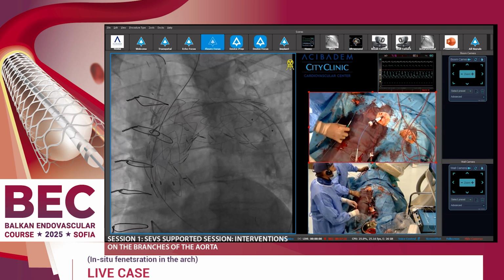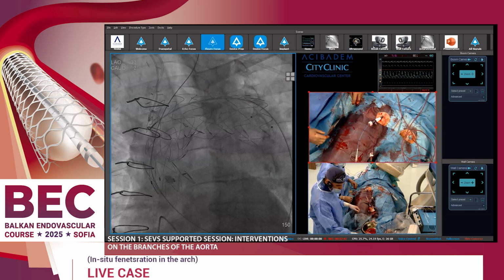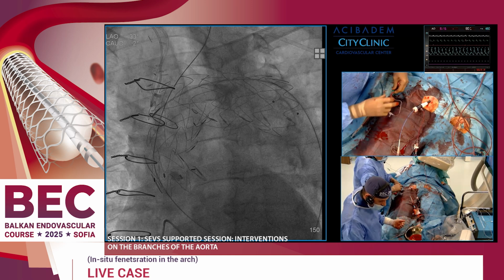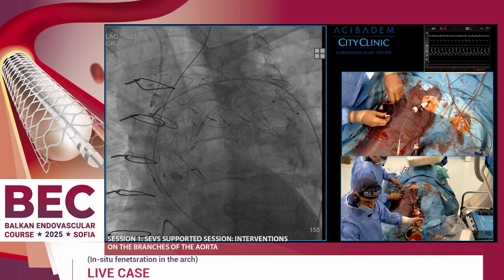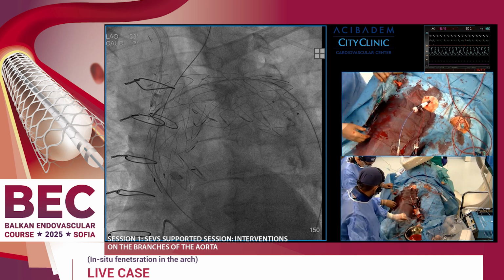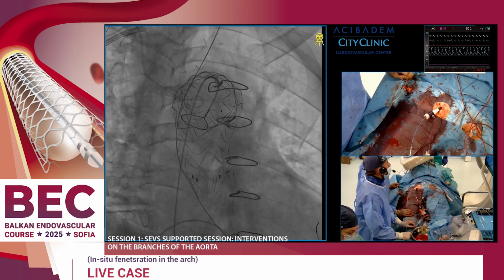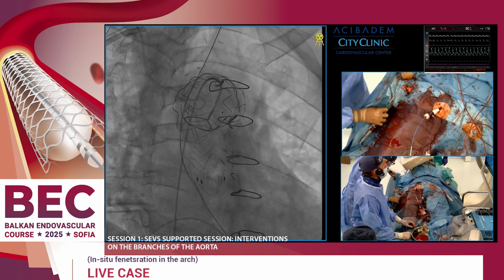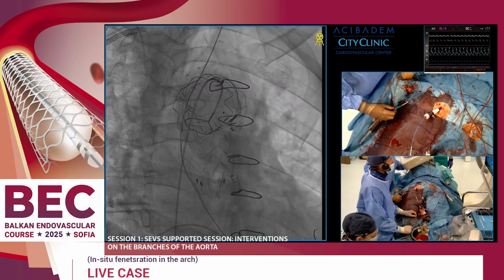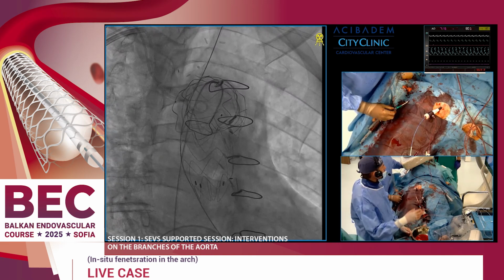More or less, something like that. Yeah, okay. I feel touching. Let's see in the right direction. Now the trick, look, Ivo, is to aim the middle of the graft, not to be too tangential. Absolutely. This is the reason we just changed the position of the panel in order to have notion in two projections. Where is the cutter? Yeah. That's good proof.